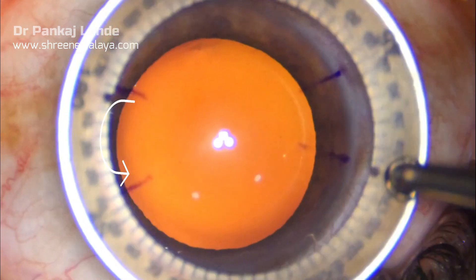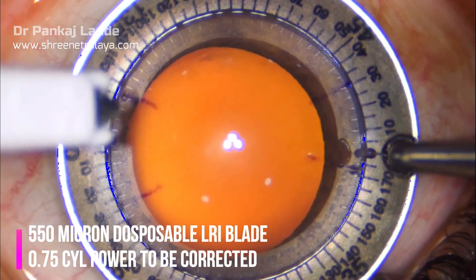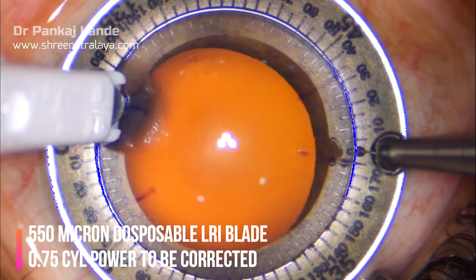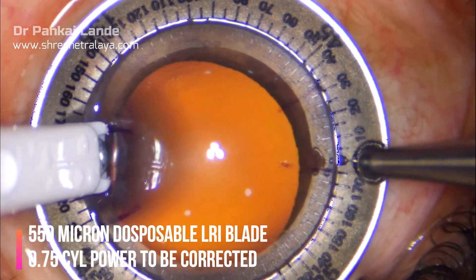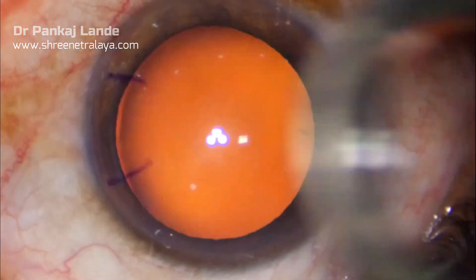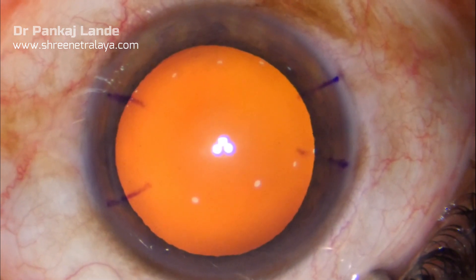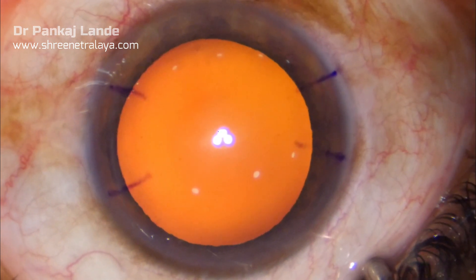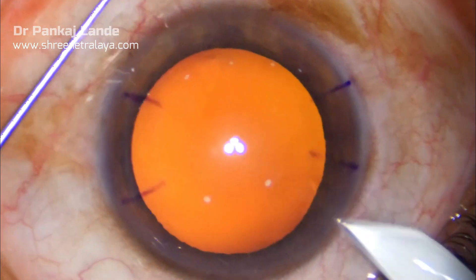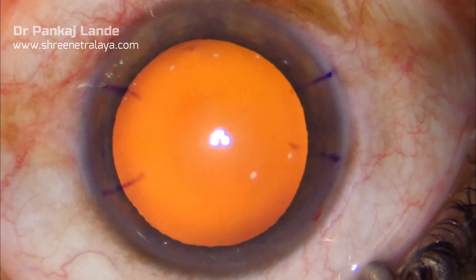This animated arrow shows the direction of LRI to be taken. Globe is stabilized with the LRI ring. Here I am using a 550 micron disposable blade. You can get blades according to different depths available in the market, and the depth to be selected depends on the pachymetry of the patient, which you can calculate before the procedure.